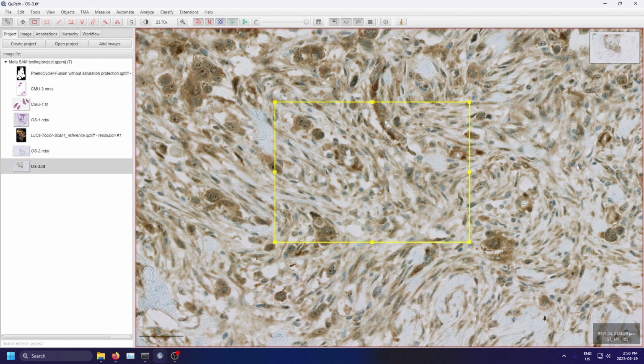Sure, here. It's not going to segment these individual hematoxylin-stained nuclei. It'll find some kind of pattern present within that image area and attempt to segment it out of whatever is considered background.